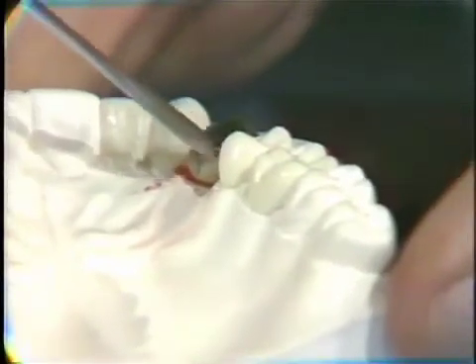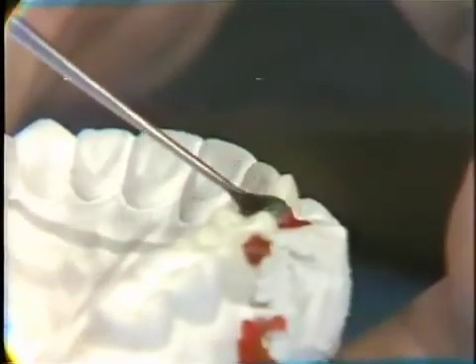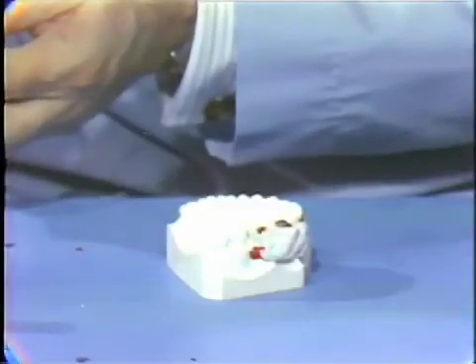you would extend over into the cuts on those retainers into which you are planning to establish the soldering lugs.